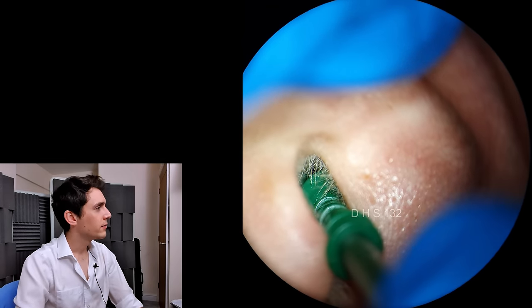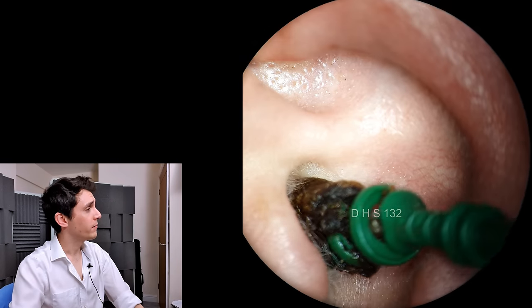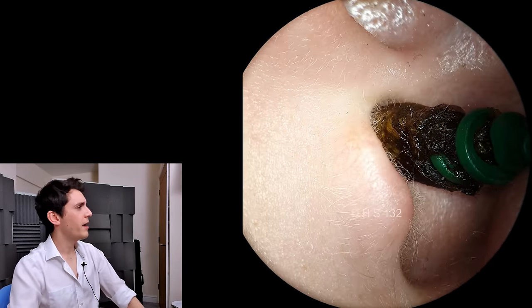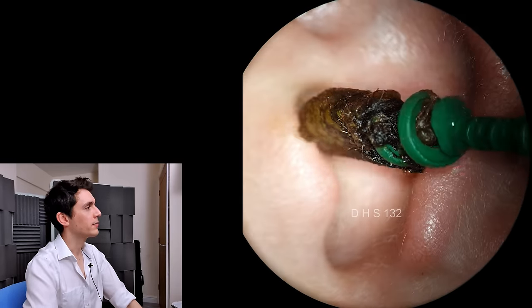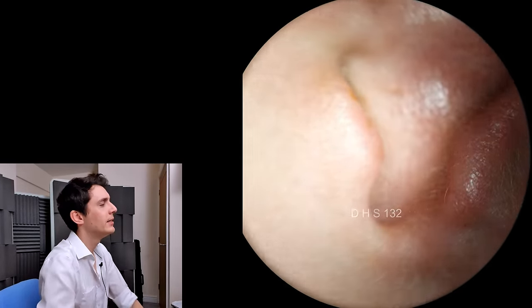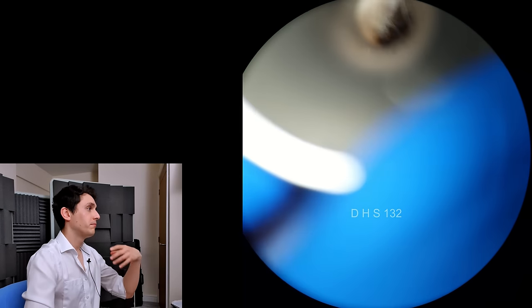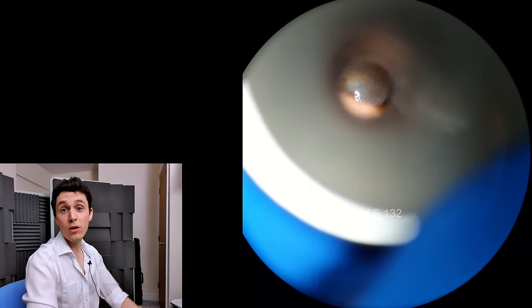I'm just going to extract the main culprit here. And there we have this very, very extensive, very dark, almost black plug of ear wax, which is a sign that it's very old wax — it's had plenty of time to oxidize. The patient felt immediately fantastic, hearing loss resolved, and the ear felt loads more comfortable.